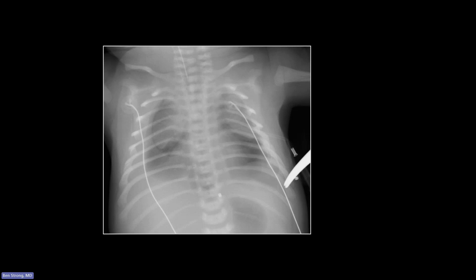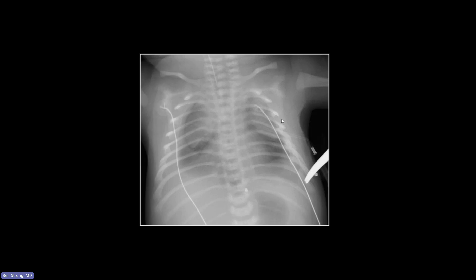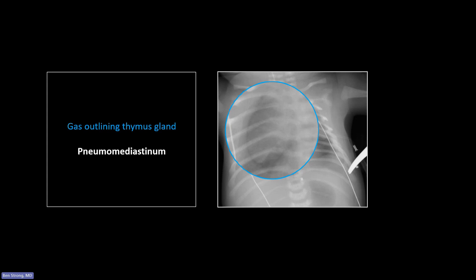This is not a normal thymus — it's outlined by gas. You can see there's more lucency here than in any of the aerated lungs. This is thymus here, and here's another lobe out here. That is too prominent. Compare it to the other thymus we were looking at — it's lifted up and spread out laterally. That is the famous angel wings sign, and that is a pneumomediastinum — that's how they present on a supine infant chest.